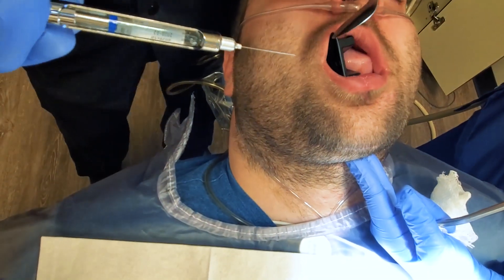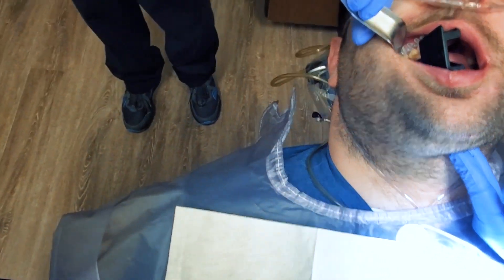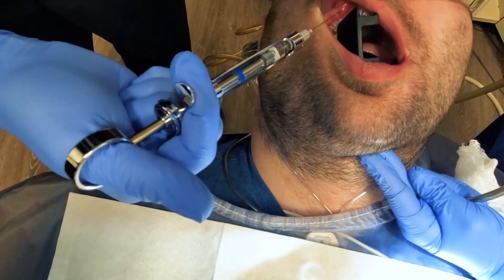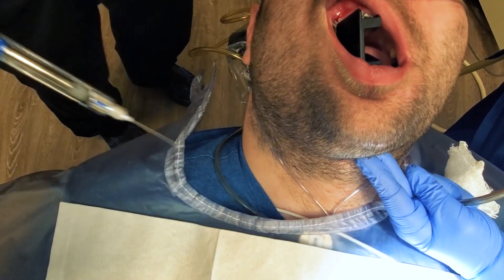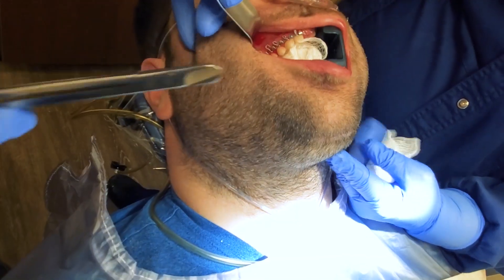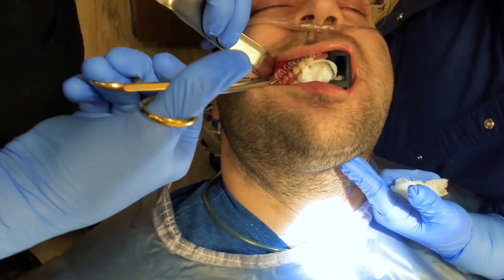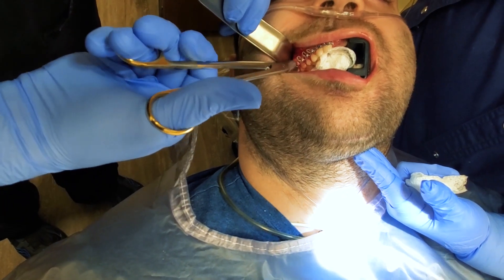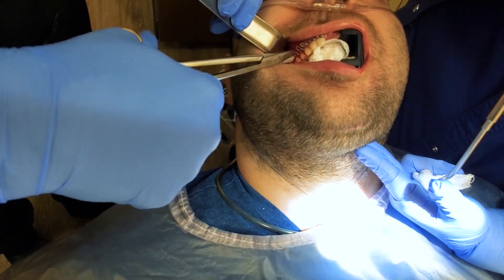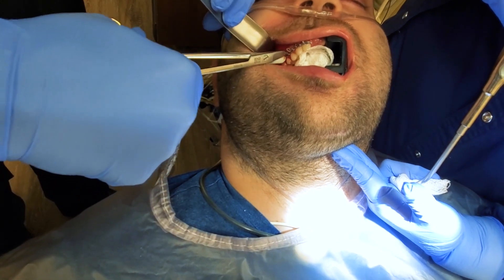Some numbing medicine over here — that's a pretty good view of the wires. We're going to take them all off, but for the sake of this video I'll show you just one section after I get them numb. With these wires, they go around the teeth. I'm going to start by just snipping these wires. Clipping the wires first.